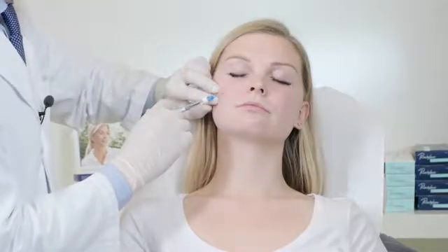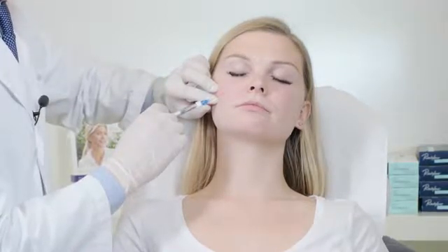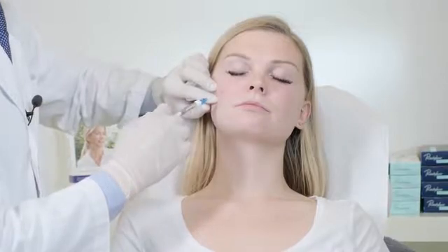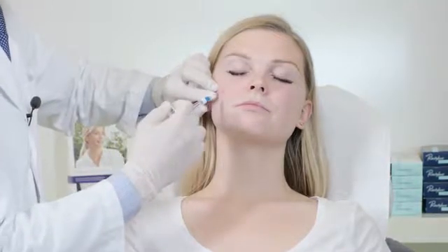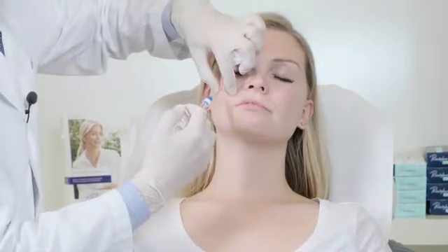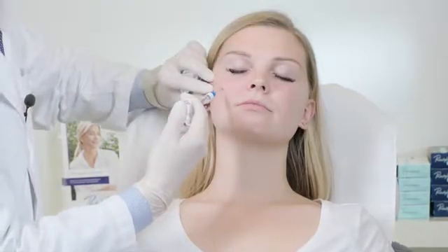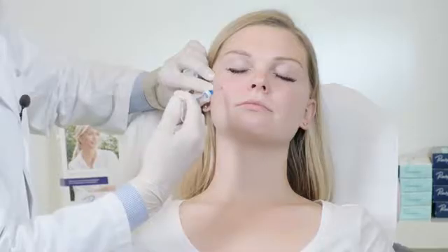It is important to inform the patient about the possibility of anesthesia all the way to the upper lip, which in our case is beneficial as we intend to treat the lips subsequently. So far I've injected 0.4 ml in a retrograde technique. I turn around the cannula, point it towards the zygoma, again lift the superficial fat pad and place a bolus onto the zygoma to create an apex for Cassandra's cheek.